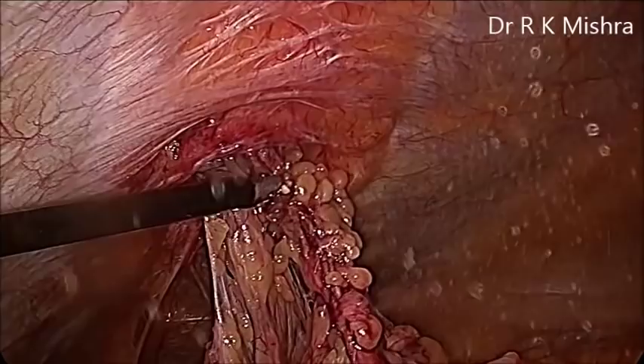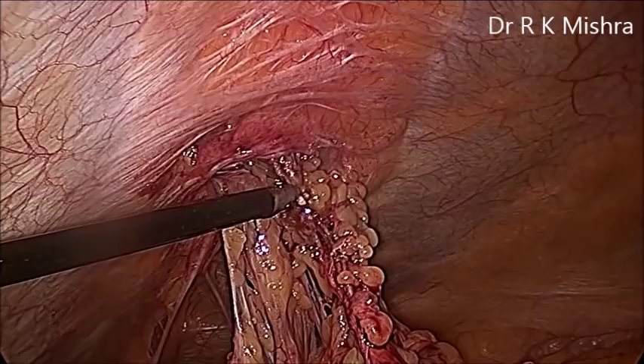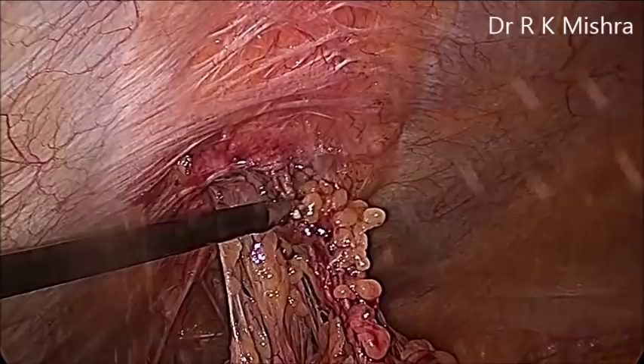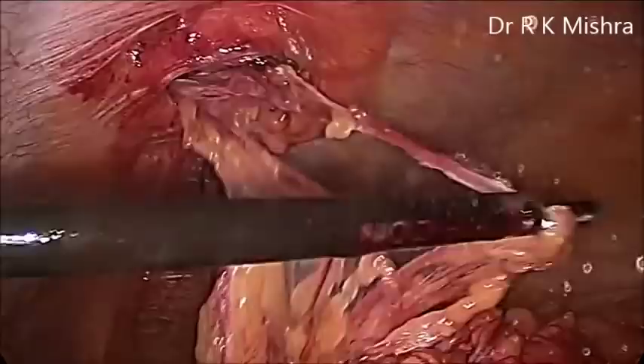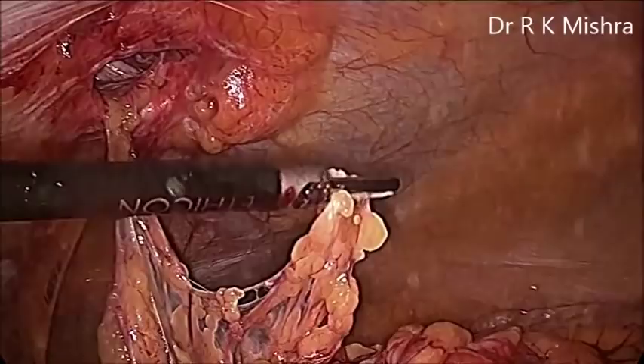Laparoscopic repair of ventral hernia is the gold standard nowadays because it has less chances of recurrence. Care should be taken — the size of the mesh should be adequate. It should be 12 cm plus the defect size. If the defect is 4 cm, it is better to keep the mesh size 16 by 16 cm, so that it covers 12 cm beyond the defect and the center of the mesh must align with the center of the defect.